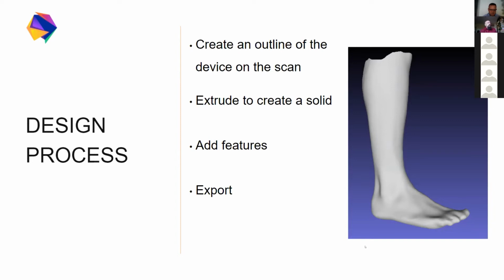To show you exactly what that looks like, I need to show you on this other machine. So if you bear with me for one second, I will try and get this started.